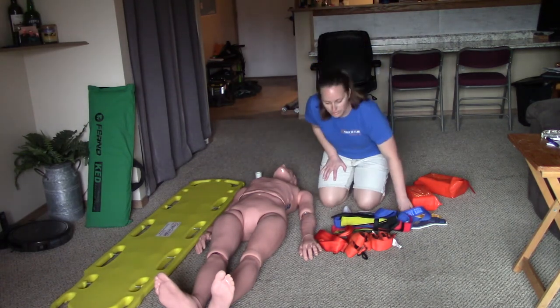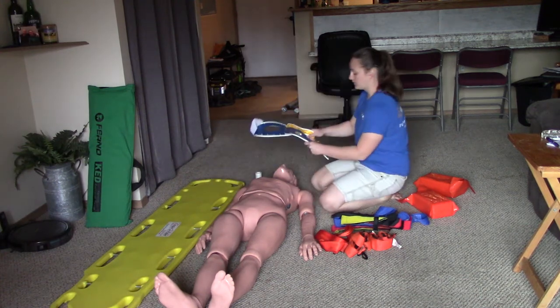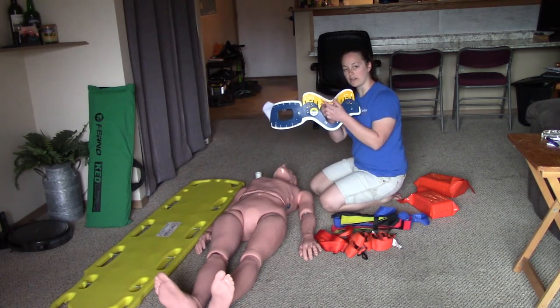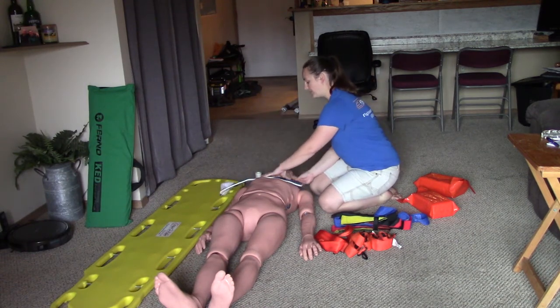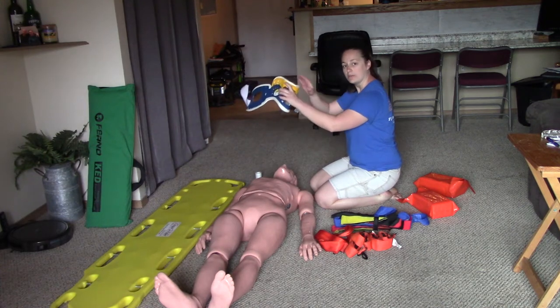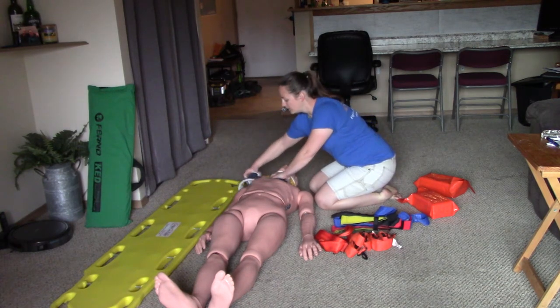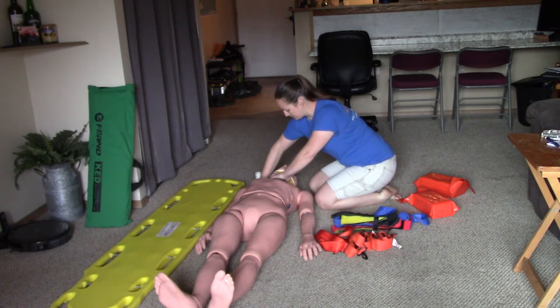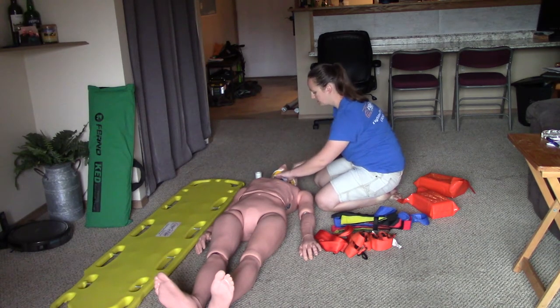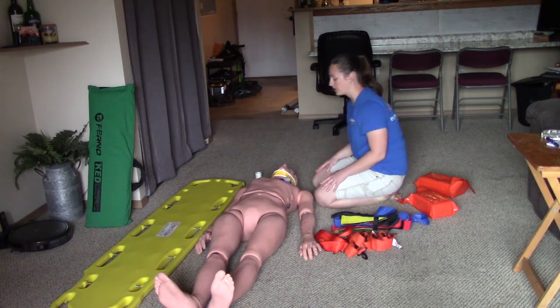I still have my partner holding c-spine. I'm now going to apply the C-collar — this patient looks like a tall, so I've adjusted the cervical collar to tall. When putting this on, I like to start with the chin piece right on the patient's chin; as you apply the collar it helps hold their head steady. I'll pinch the collar, put their chin in the chin piece, hold that steady with one hand, then use my other hand to bend and force the collar under the patient's neck. Once it comes out the other side, pull as tight as possible and velcro the collar. If the velcro isn't sticking, you can tape the collar closed.